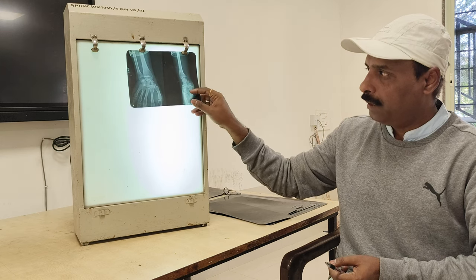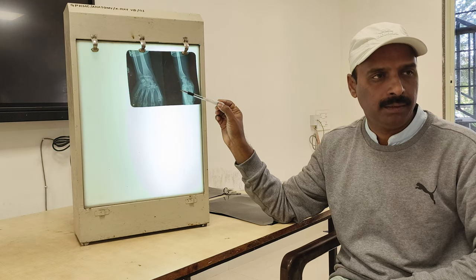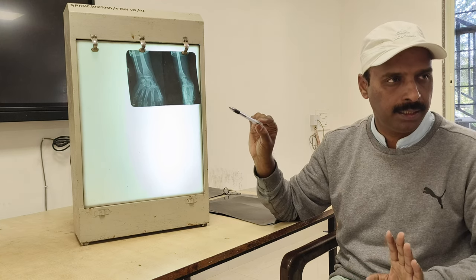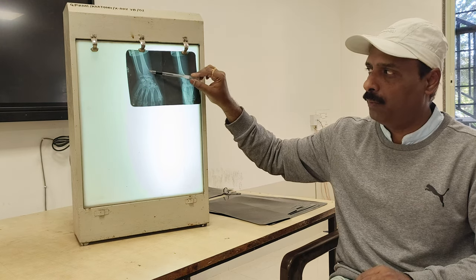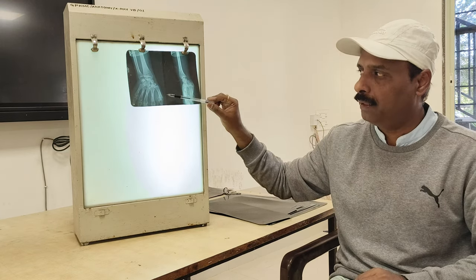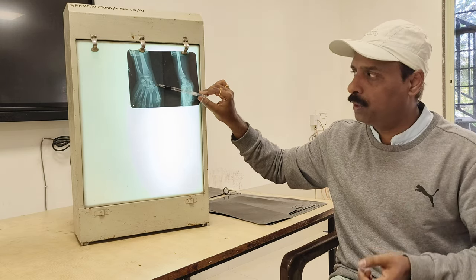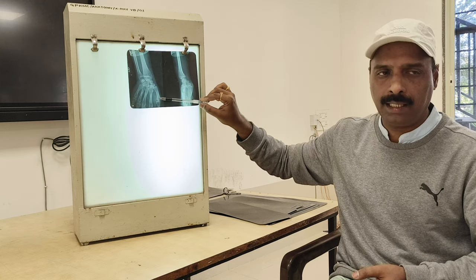In this plain x-ray we also get the wrist joint. The wrist joint is maximally highlighted, and we can see the lower end of the radius and ulna. You can call it a plain x-ray of the wrist joint. You have to identify all 8 carpal bones that are properly seen here. The hook of the hamate is identified, the hook is seen here, which you have to remember. After the 8 carpals, we have the metacarpals and phalanges.